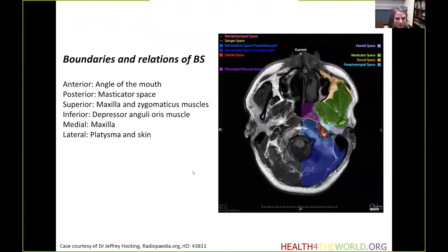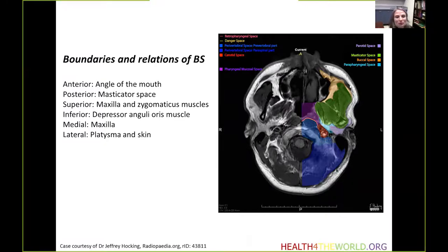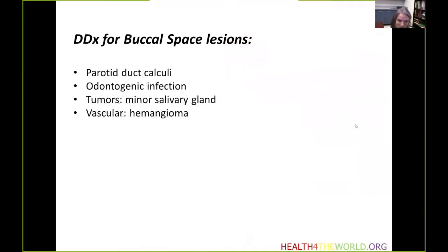The boundaries of the buccal space: posteriorly it has the masticator space as a neighbor, and immediately anteriorly it is bounded by the bone. Laterally, you see the zygomaticus muscle, the skin, and the platysma. The differential diagnosis for buccal space lesions would primarily include parotid duct calculi and associated infection or inflammation, dentogenic infection, tumors of minor salivary glands, and vascular lesions such as hemangioma.